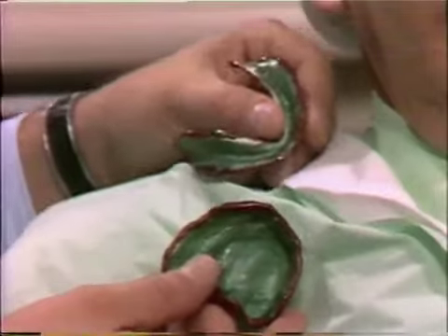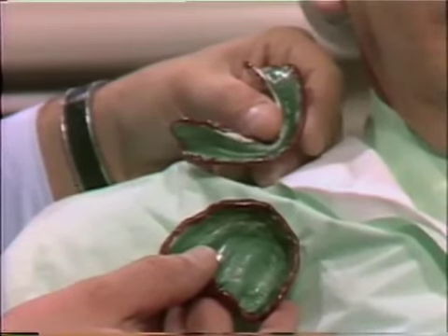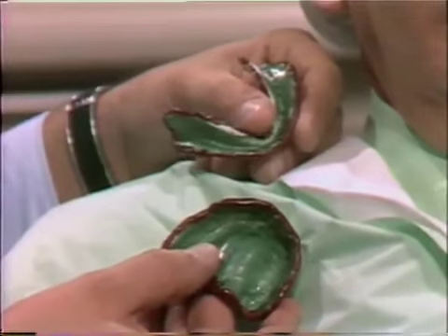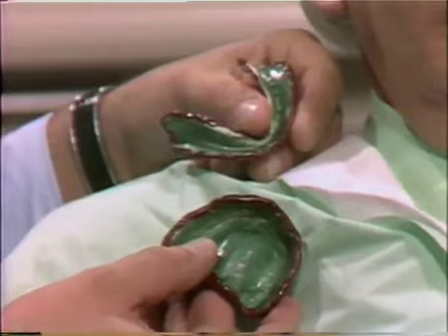We have just completed the border molding procedure. It didn't take very long because our trays were accurate in most areas. In our next sequence, we will be going back to the laboratory and removing the wax spacer, placing a wax occlusal rim on the lower tray, and placing a number of relief holes in order to decrease the compression and pressures within the final impression.